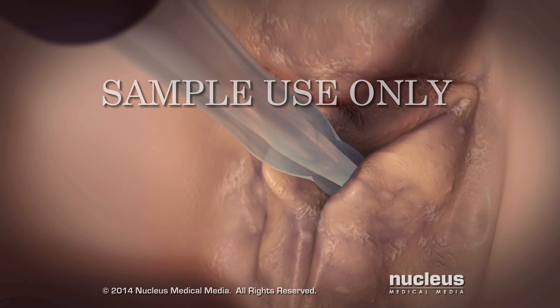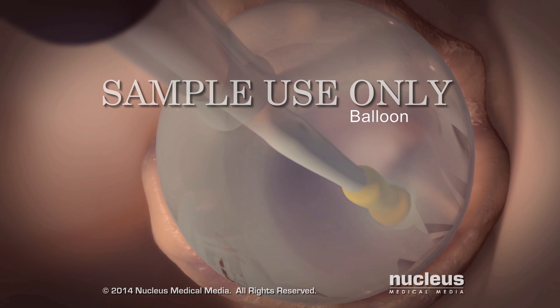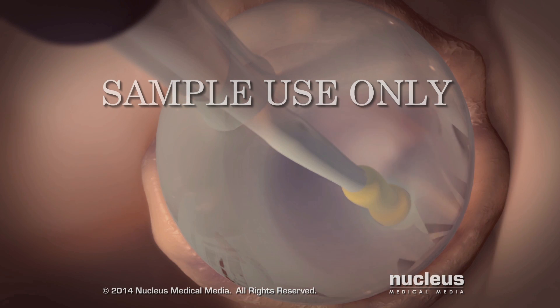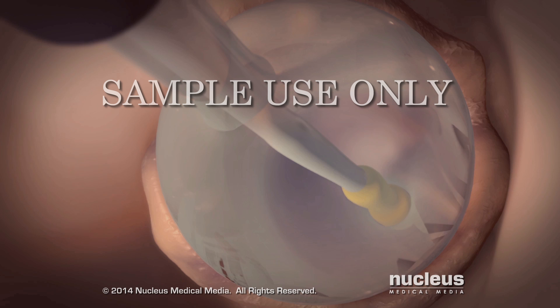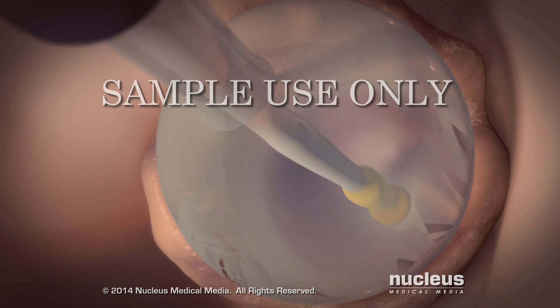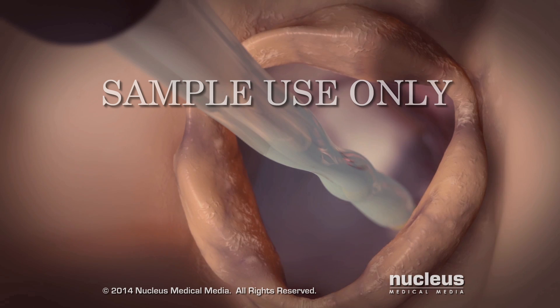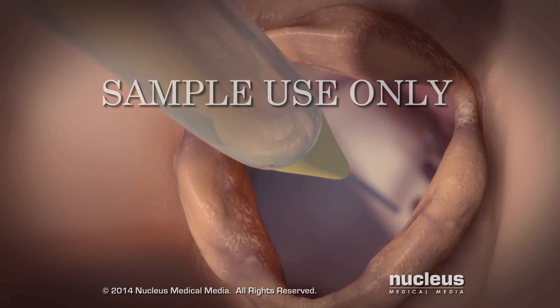A balloon on the tip of the catheter will be inflated to widen the opening in your aortic valve and push the valve leaflets to the sides. After deflating the balloon, your doctor will remove the catheter.